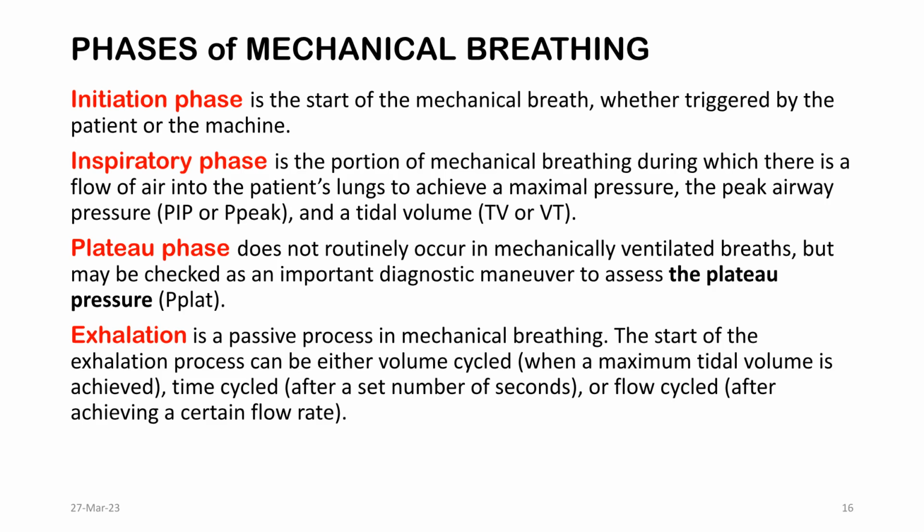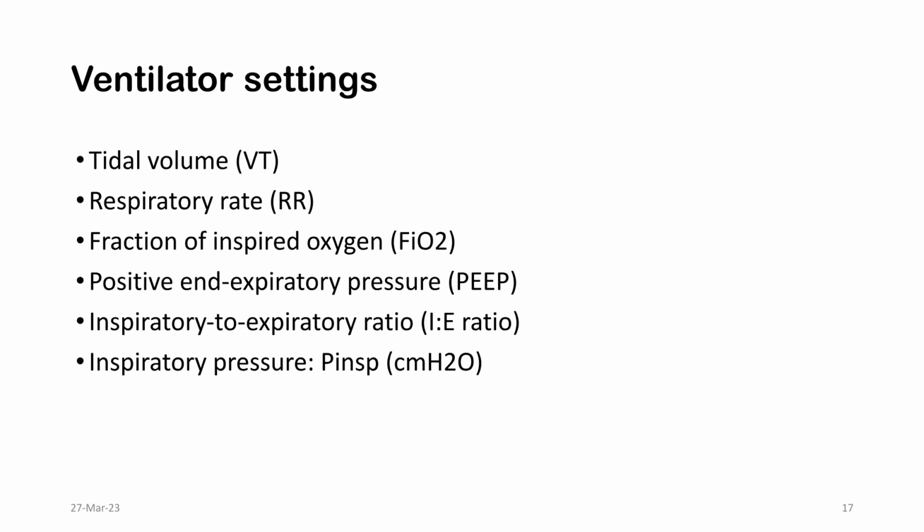The phases of mechanical breathing include the initiation phase, inspiratory phase, plateau phase for diagnostic assessment, and exhalation, which is a passive process. Important ventilator settings are tidal volume, respiratory rate, fraction of inspired oxygen, positive end expiratory pressure, inspiratory to expiratory ratio, and inspiratory pressure.